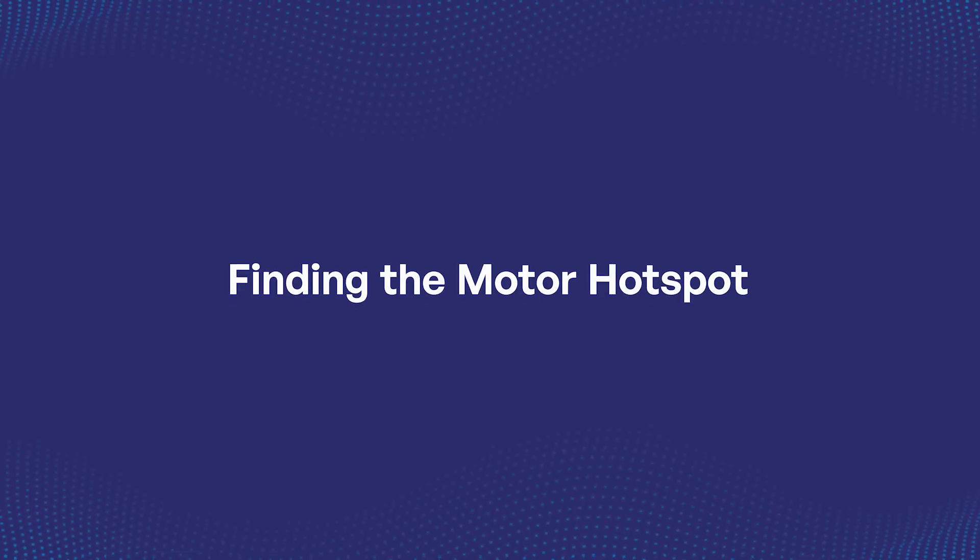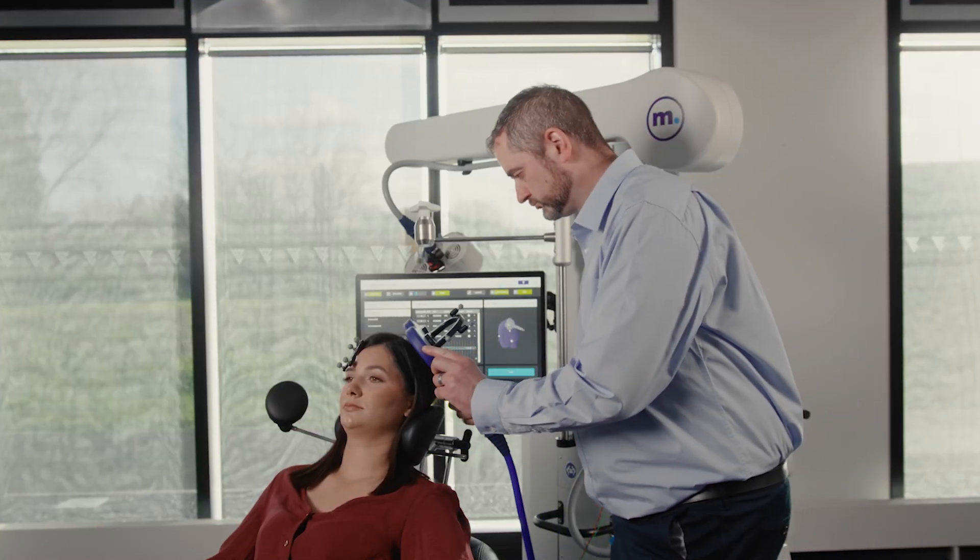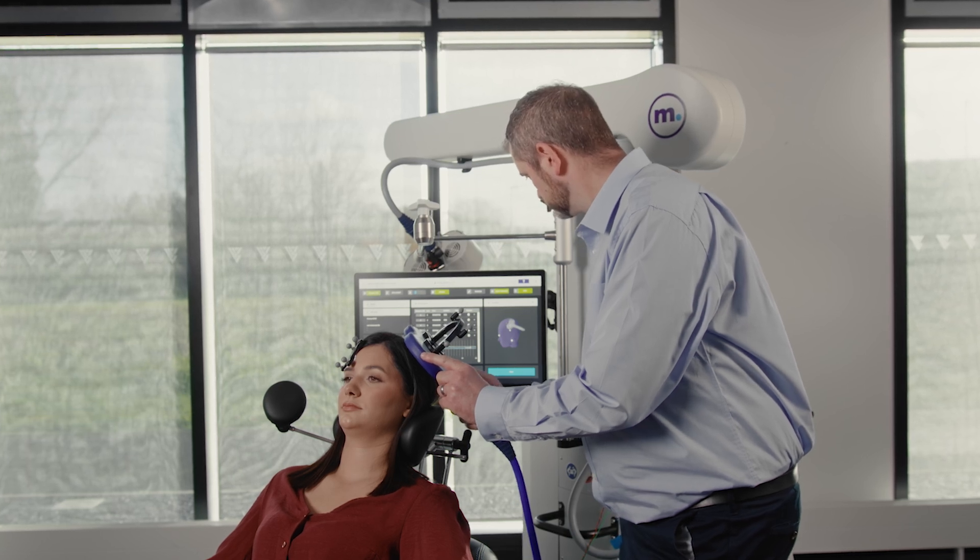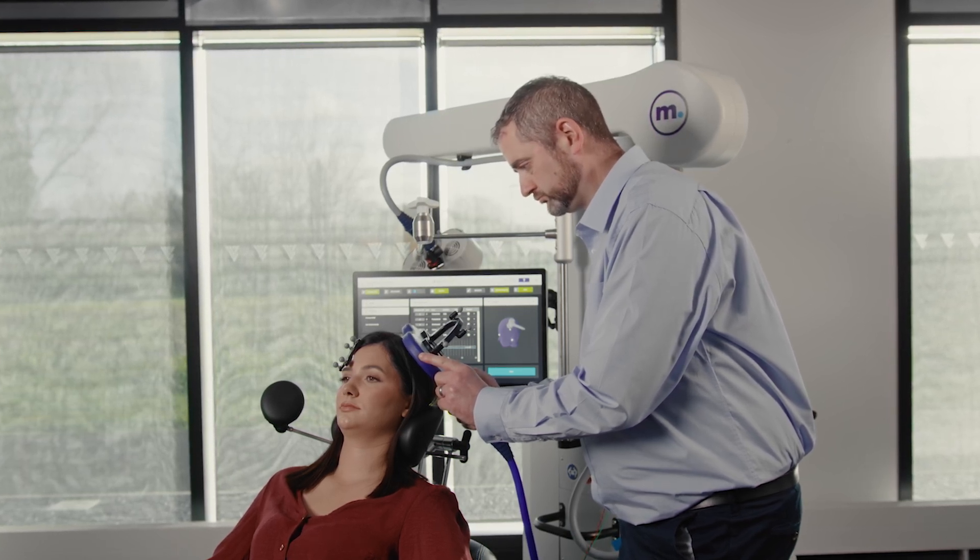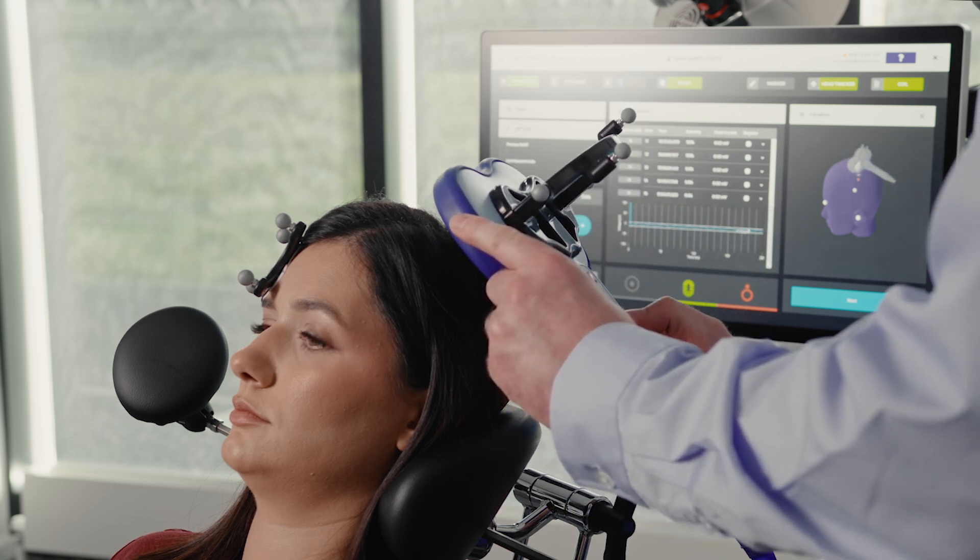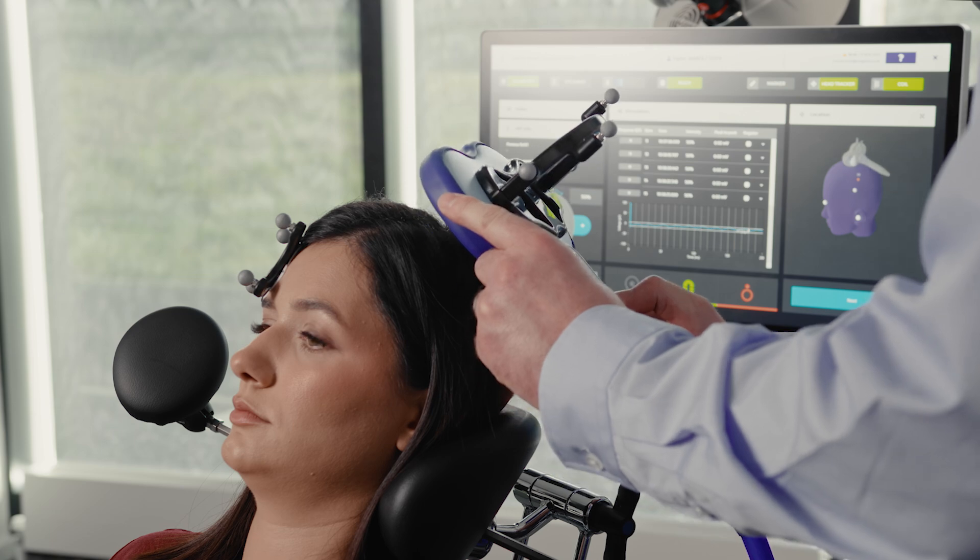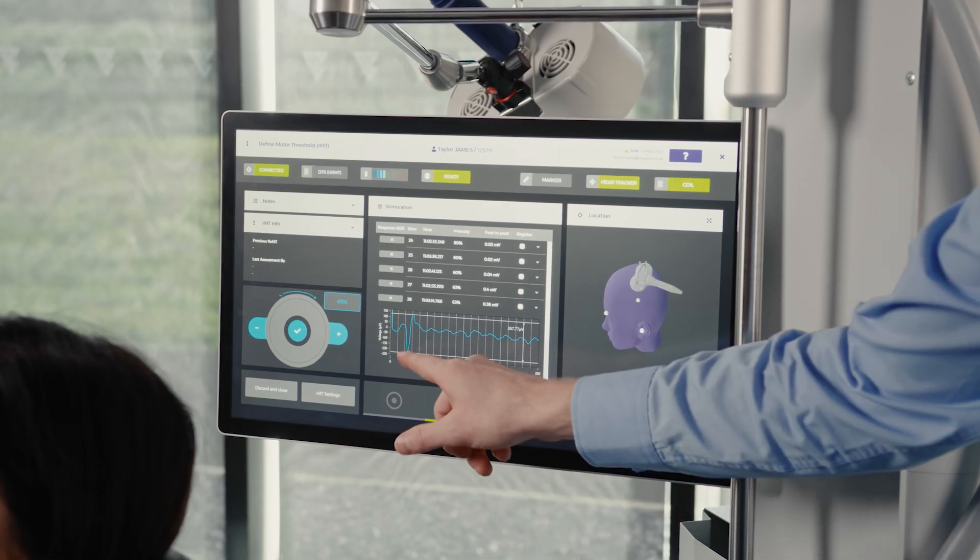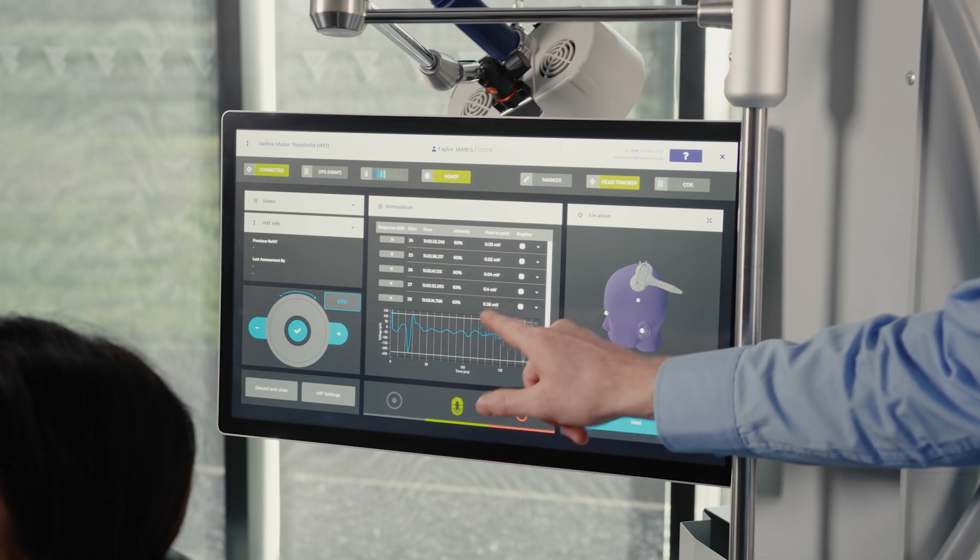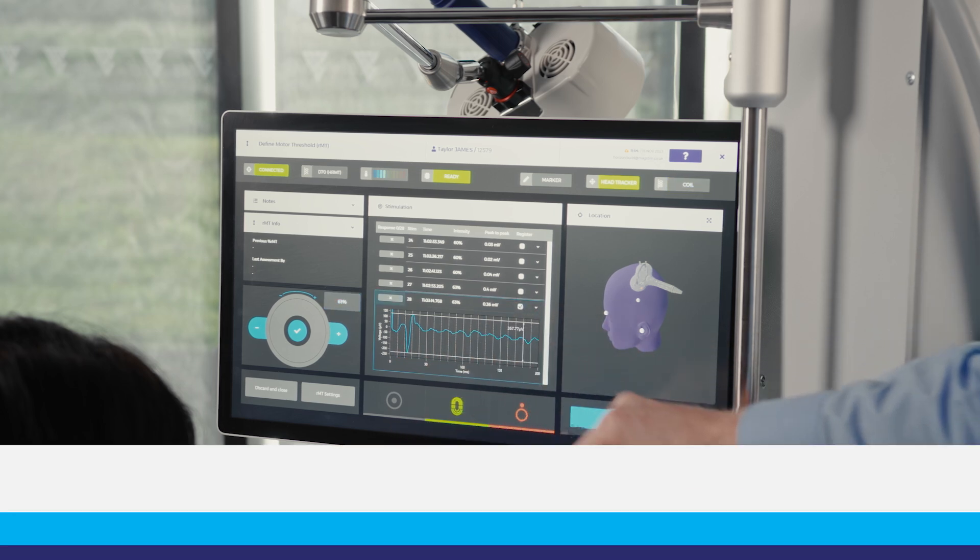Finding the Motor Hotspot: Using the stimulator output defined by the previous steps, deliver one pulse one centimeter above C3. Continue searching in a grid pattern for a minimum of 9 pulses, at least 2 seconds apart. From the Stimulus List panel, select the stimulus that corresponds with the strongest response to visualize the coil's location on the Horizon UI location window.